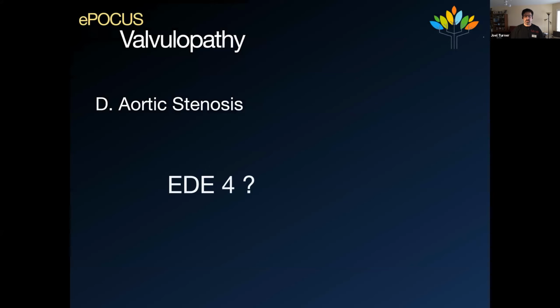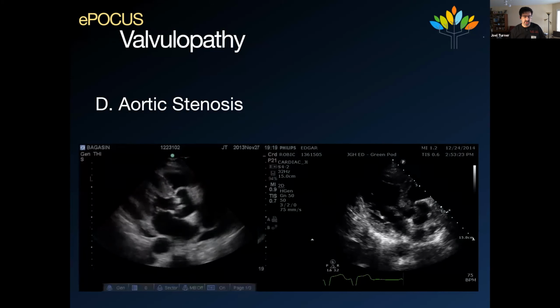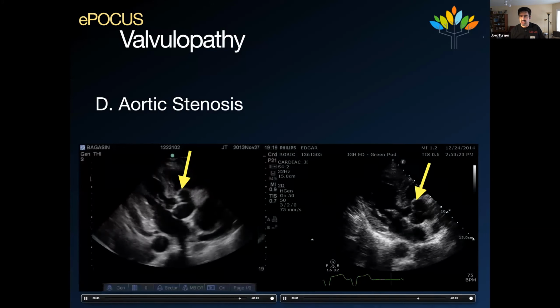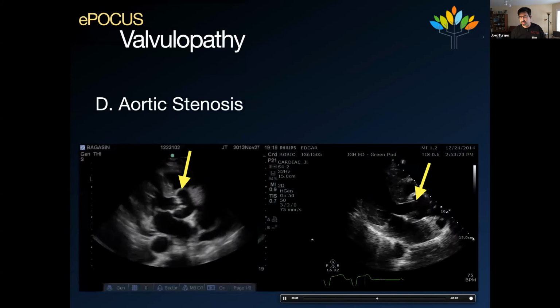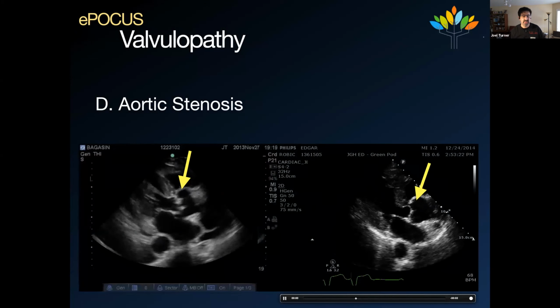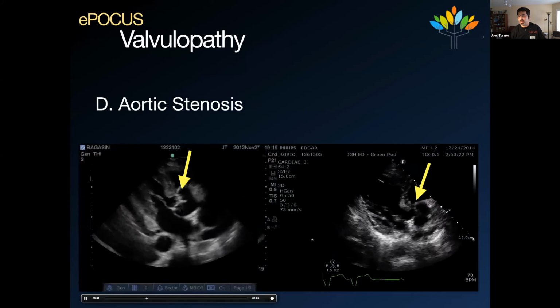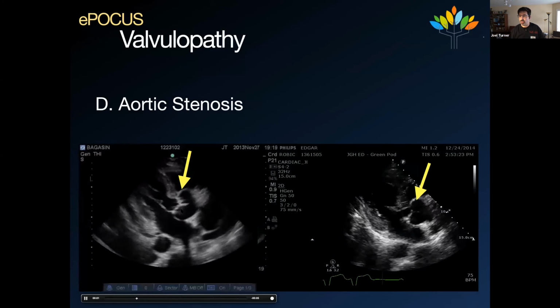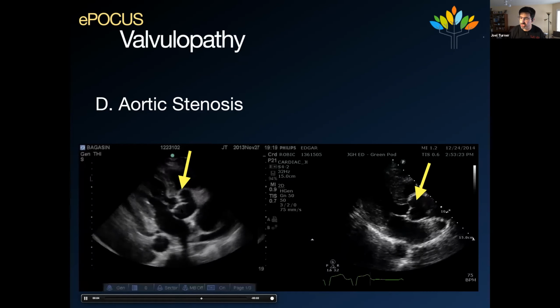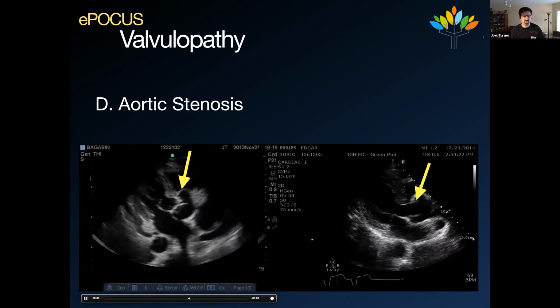Like I said, it is a much more complicated thing. Take a look at the aortic valve. If you see this valve right here that's opening up really wide, don't bother. There's no aortic stenosis of concern, and the patient who may have syncope, it's not because of this. If you're seeing this, where you have a very calcified aortic valve and it's barely opening, then yes, I would use that as my trigger to potentially get a cardiologist to assess the aortic valve based on your 2D assessment.